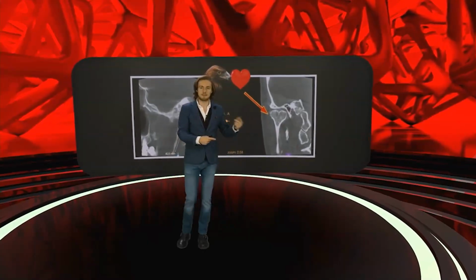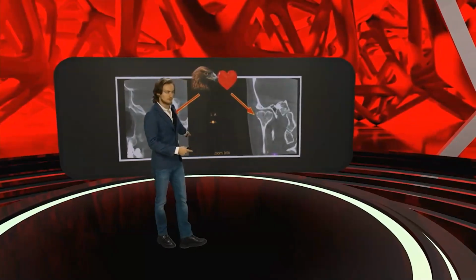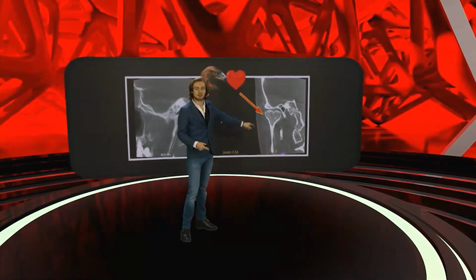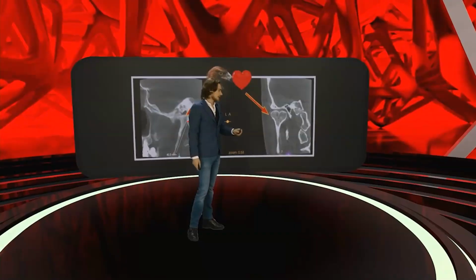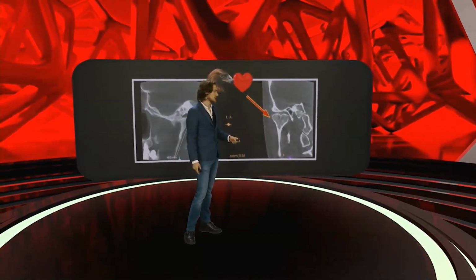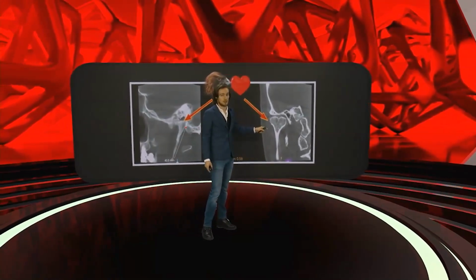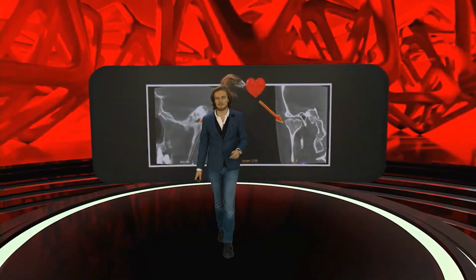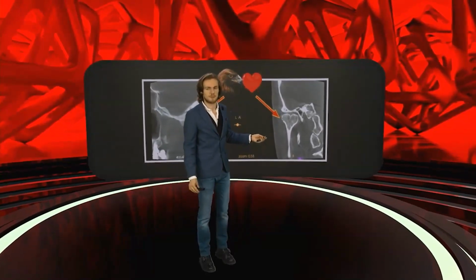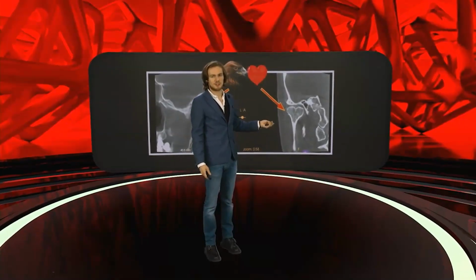Funny thing is, this is the same patient that I found in my office. Styloid process, very long, and a bifid condyle. The theory about a bifid condyle is very complex. Some people say this is a developmental problem. Some people say this is because of trauma. But the thing is that sometimes you will see it with your patient just accidentally. This is very often asymptomatic, so this is not a real problem for your patient. Bifid condyle is not that big a problem for your patient.